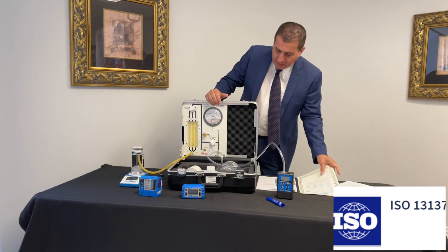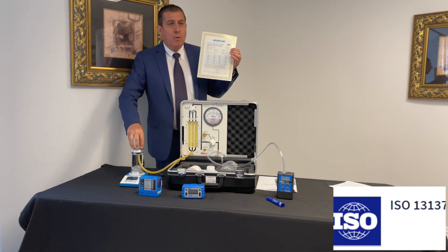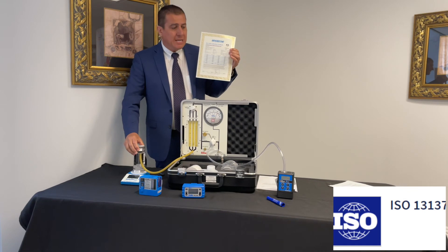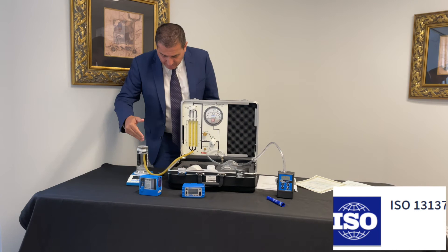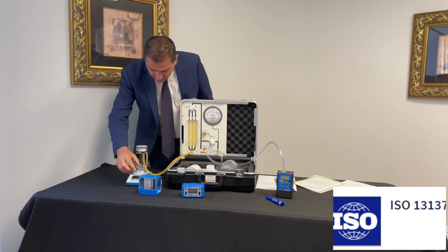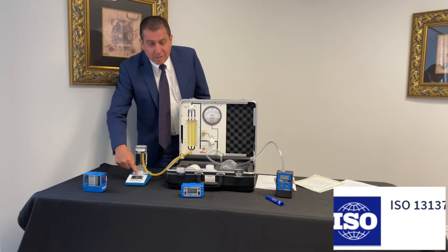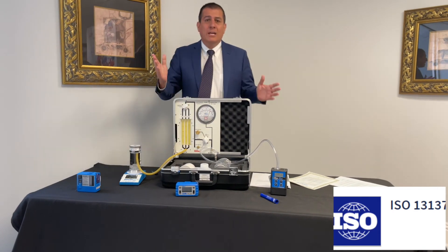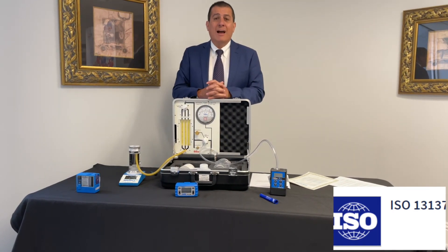It is very important to make sure that the primary flow calibrators have their certificates according to ISO 17025. Here I have a primary system generating more than 40 inches of back pressure. With my primary flow system, I'm going to generate a bubble of 3000 cc's — 3000 cc's at more than 40 inches of back pressure.